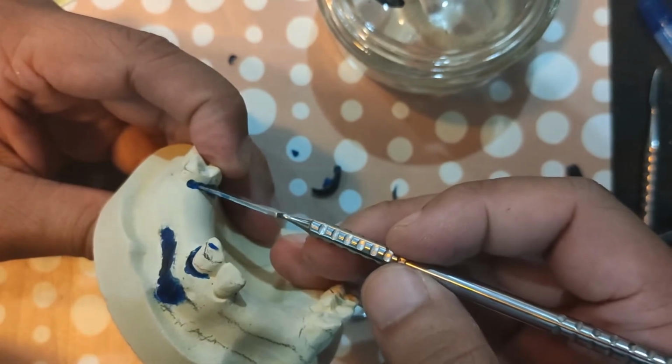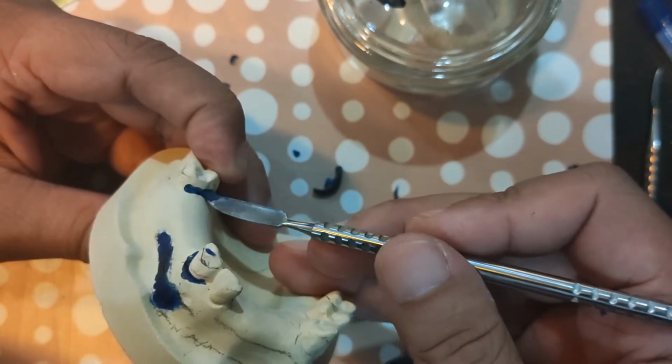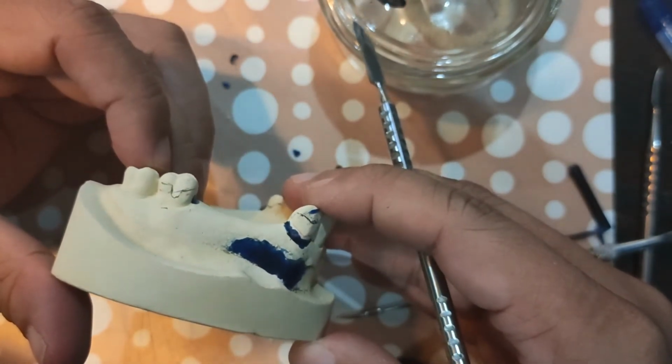Here also, where the proximal plate is going to come up, the undercut immediately below the guide plane needs to be covered with a parallel blockout. Okay?